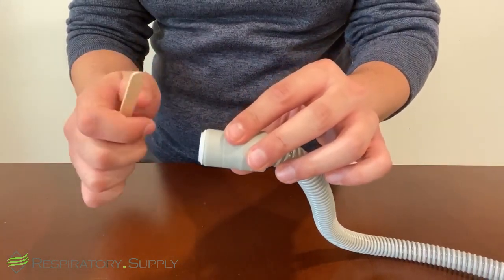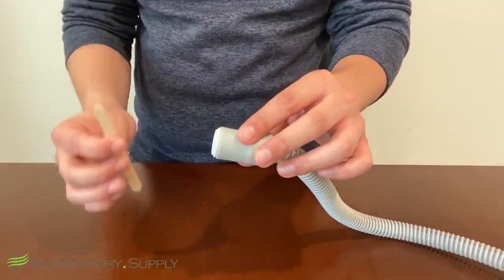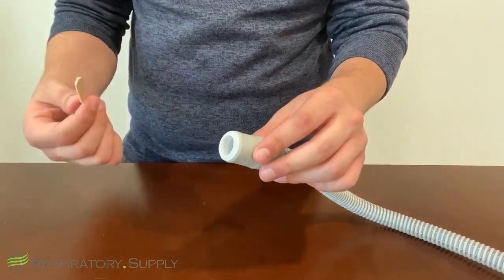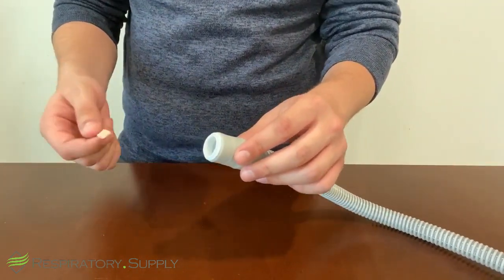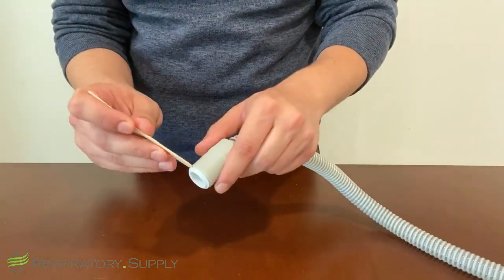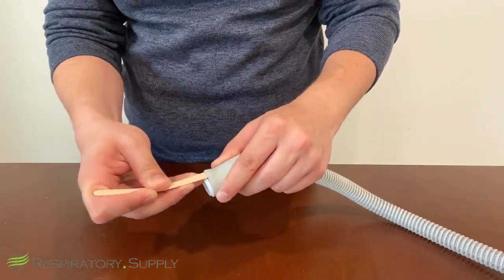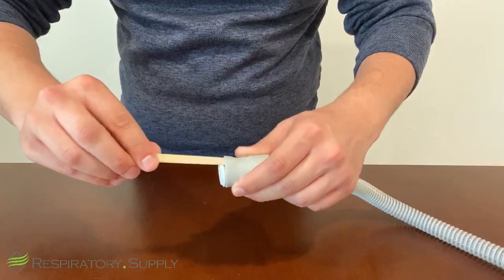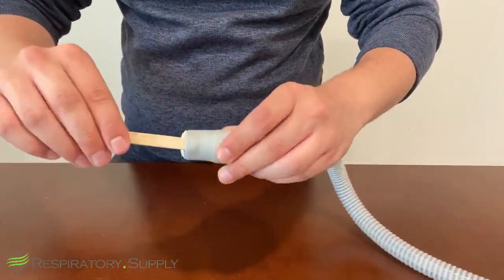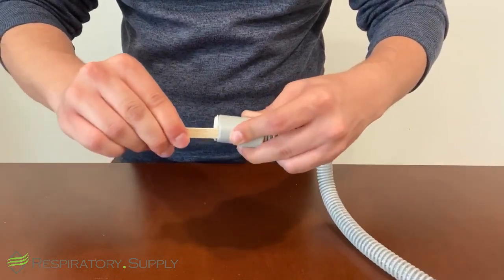But one of the best ways to get it out is using a small tool like this. I prefer a popsicle stick with a rounded edge, smooth, so that way we do not damage the rubber. And we're going to take the popsicle stick and insert it between the rubber and the connector. This will break the seal and allow us to shimmy out the connector so we can attach our new mask. So once again, very important that we are gentle. We can start by slowly inserting the popsicle stick between the rubber and the plastic, as you can see here. You want to make sure the rubber does not fold in on itself. It should just be right under there. And you can shimmy in the popsicle stick like this.